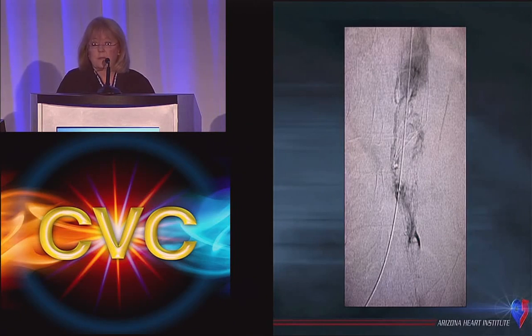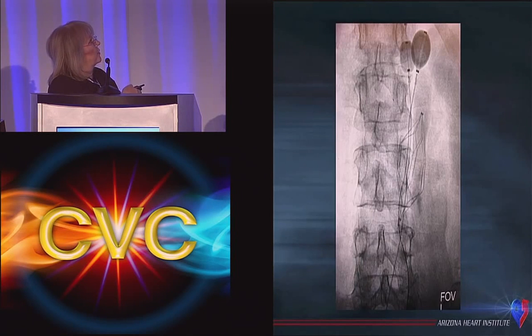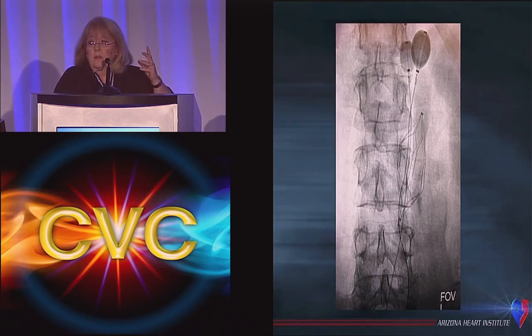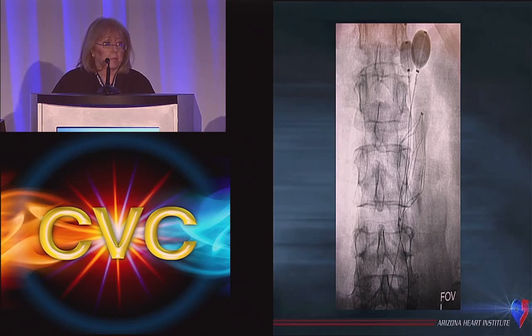And here's the IVC filter, full of thrombus. And here's what I call party trellis. When they're going around, it looks like two little balloons at a birthday party. I didn't know at first if there were any contraindications of doing this, so I checked with the rep, and he said no. And in fact, as Dr. Montero Baker said, there were no problems with doing this.